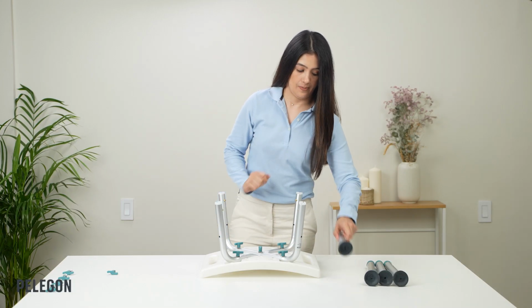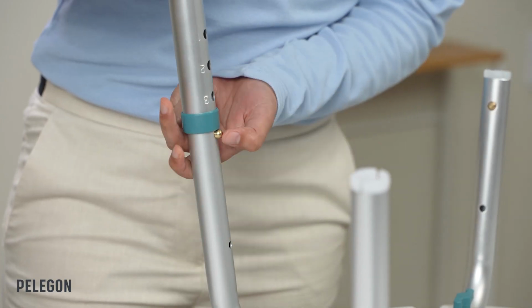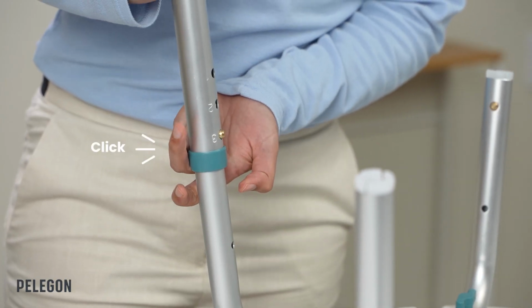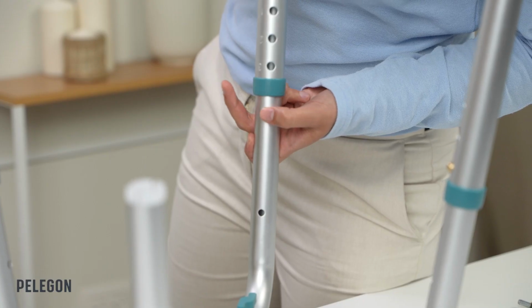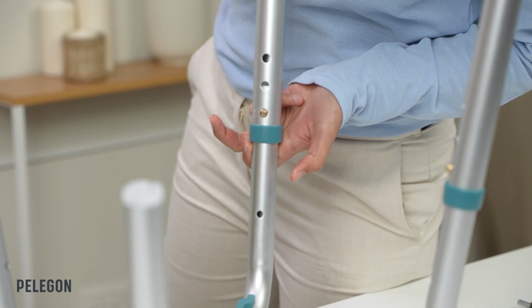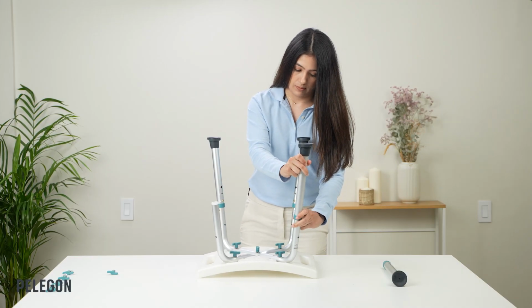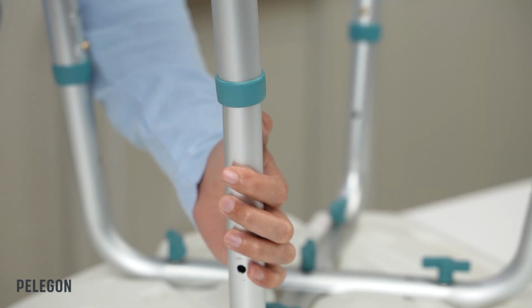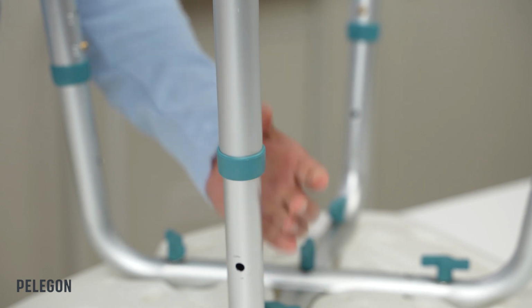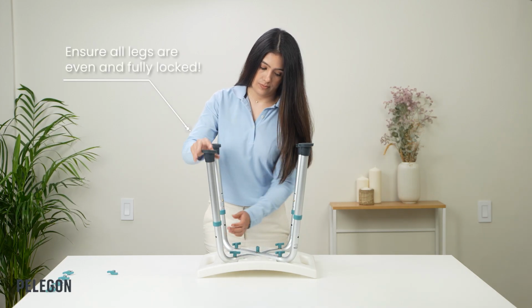Now let's attach the 4 legs. They are all the same, so the order does not matter. What is important to make sure is that all legs are even and fully locked.